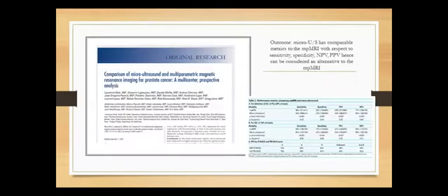So just an article to show us, a multi-center prospective analysis that compared micro ultrasound to the multiparametric MRI.